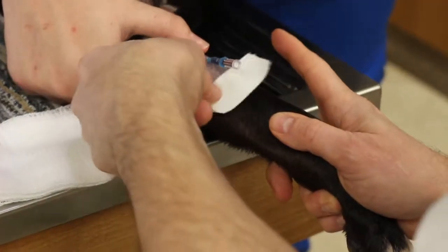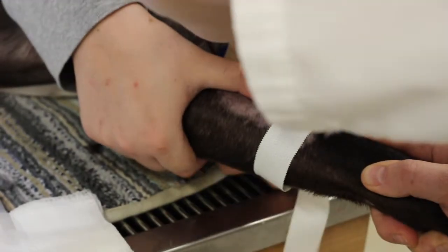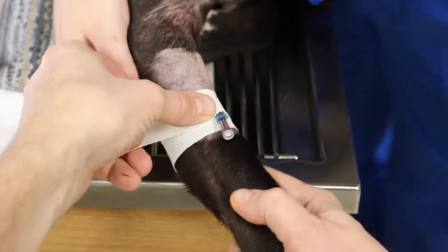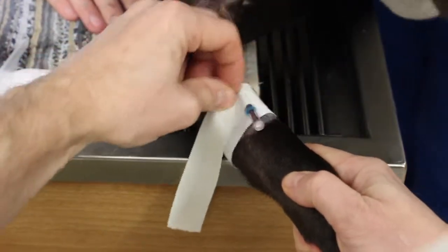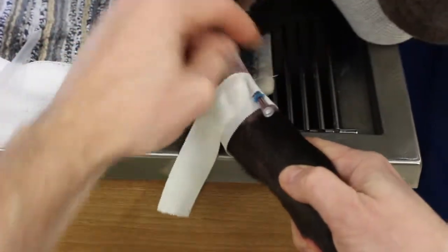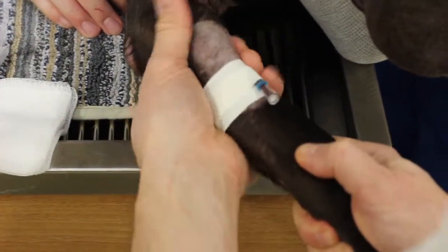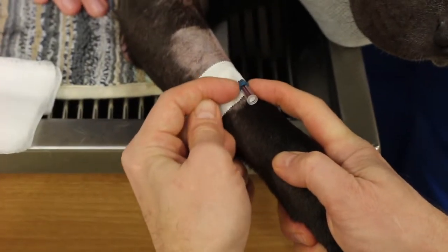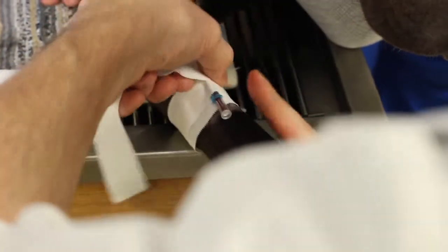So then I do this tape wrap. Everybody has their own system, but I do one underneath here and around. I come around here snug on the dog's leg so that when the skin moves, the catheter will be attached to it. Then I go around the catheter and pinch it to the catheter, because I think this is the most important part — it's holding the catheter to the tape and to the dog's leg. Then I go snug around here. I leave myself a little gap so that any port I want to put on there, I can have room to thread it on.